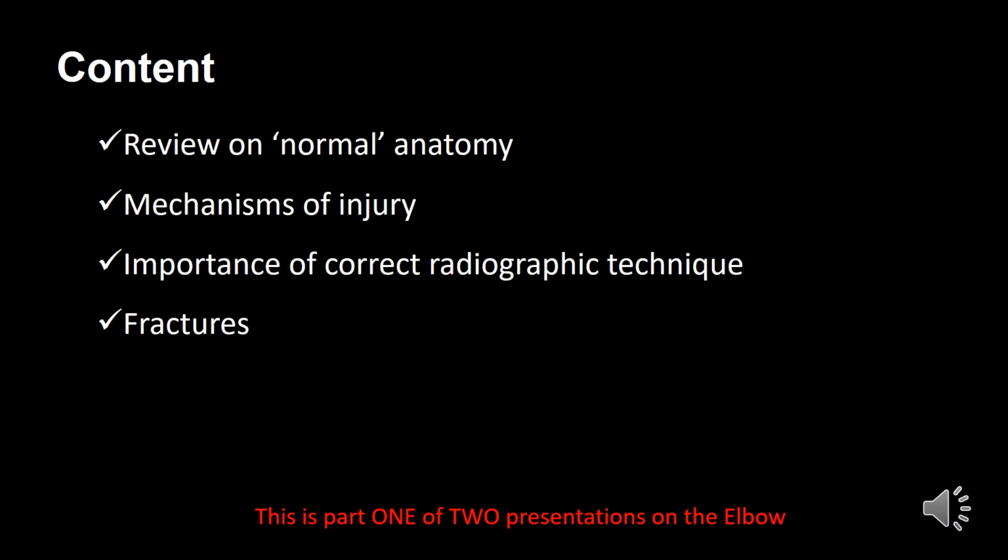Hello and welcome to part one of two presentations on the elbow. We start with a short review of the normal anatomy, and then we'll look at mechanisms of injury, the importance of the correct radiographic technique in acquiring the images, and then we'll use clinical cases to demonstrate a range of fractures.